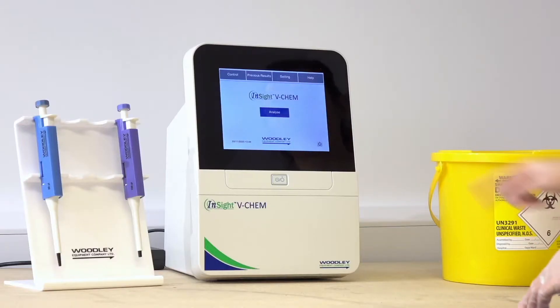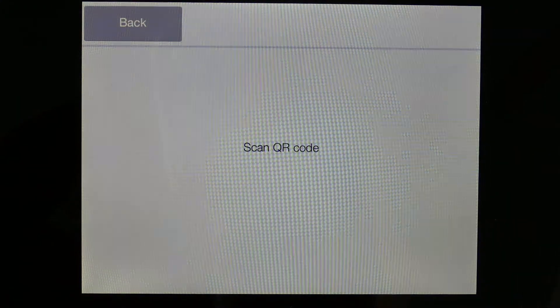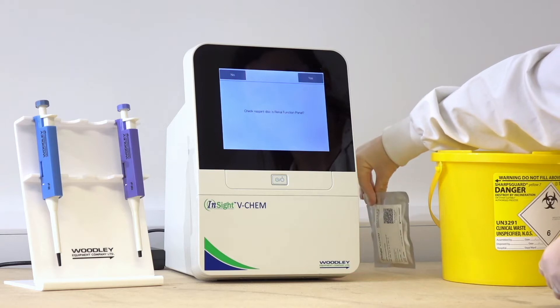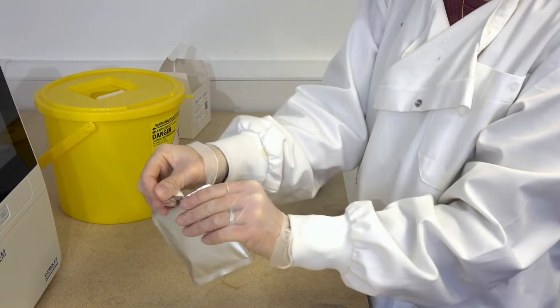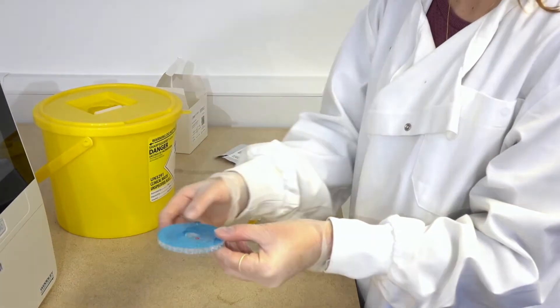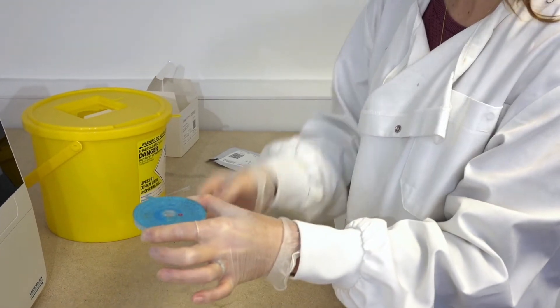To run a test, press Analyse on the analyser screen. Select the sample type. Scan the QR code on the rotor foil pouch on the side of the analyser. The QR code contains calibration data, lot number and expiry date information. Select Yes to confirm the correct rotor type is being used. Carefully open the foil pouch and remove the rotor. Opened rotors must be used within 10 minutes. Remove the foil tab from the rotor to release the diluent by pulling the tab.